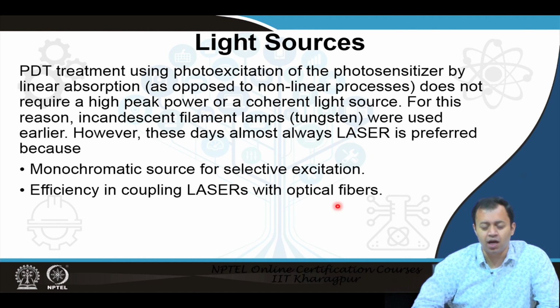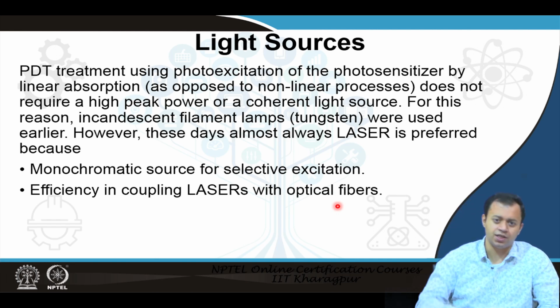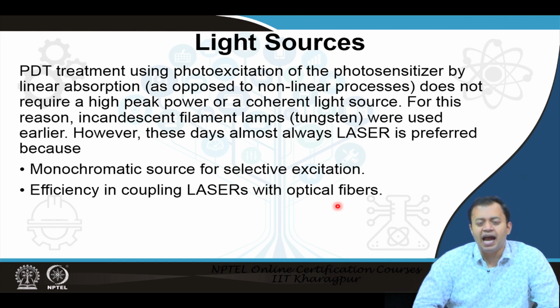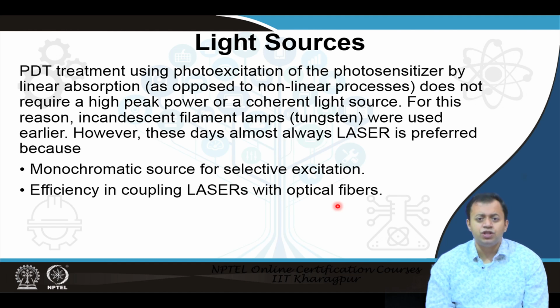You know this, optical biopsy is happening. There is more than one fiber: one sends a specific amount of light, and after hitting the tissue, the light is extracted. The extracted light is taken back by another fiber nearby and analyzed, and you get information about the properties of the area that the light is hitting. So, why can't we do this here?